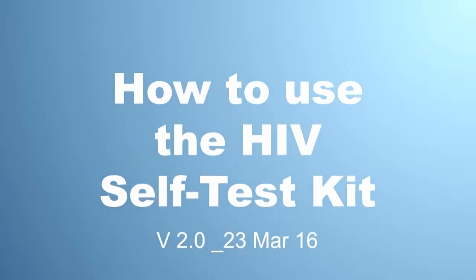How to use the HIV self-test kit. This is a video that shows how to test yourself for HIV using OraQuick. This test uses a sample collected from swabbing your gums and has been shown to be effective and safe. This video is a step-by-step process and follows the instructions provided with the test kit.